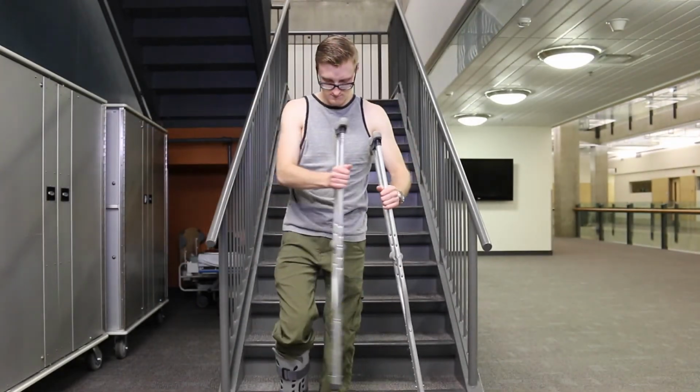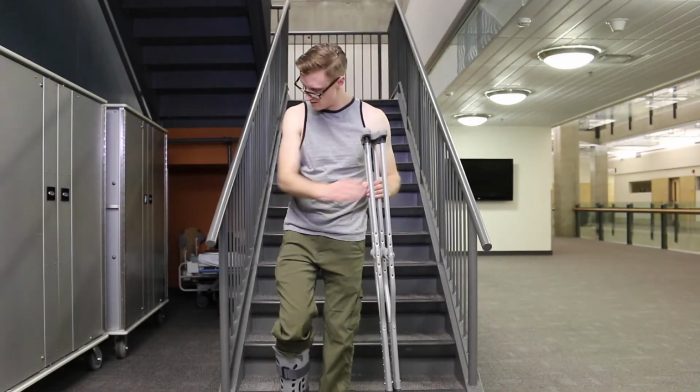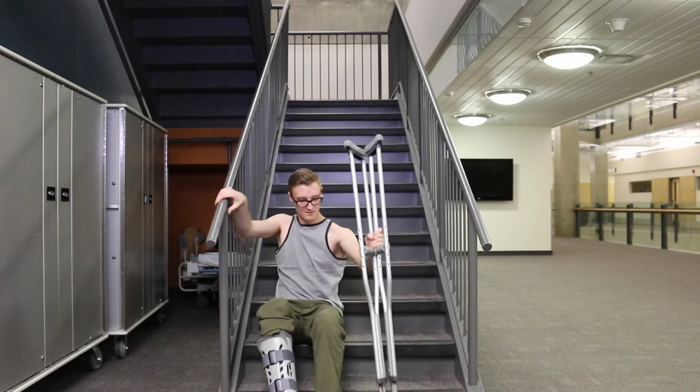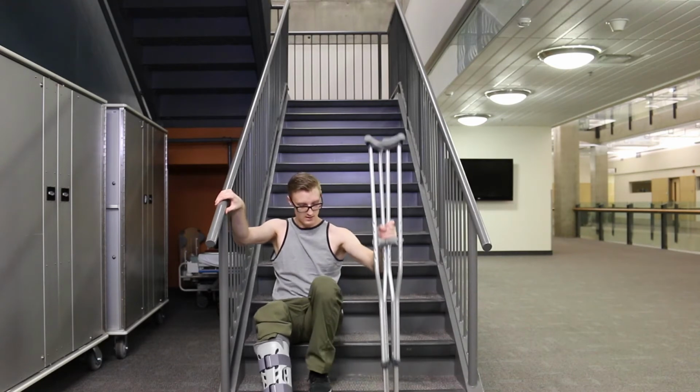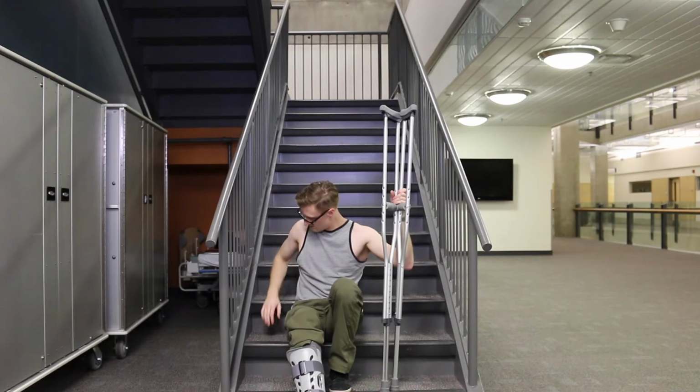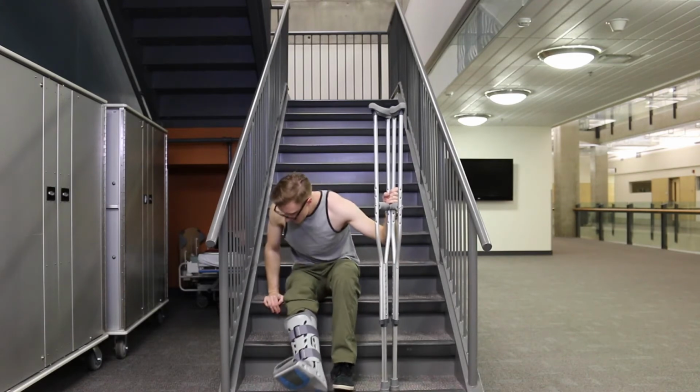Another way to go up and down stairs is to hold both crutches in one hand and sit on the bottom step. With your free hand, put the palm onto the higher step and push off with the good leg and hand to lift yourself onto the next step. Bring the crutches up and have your injured leg follow.